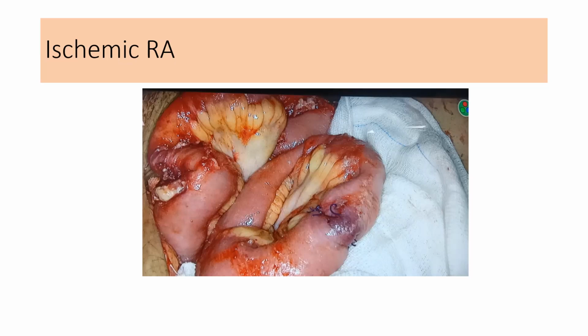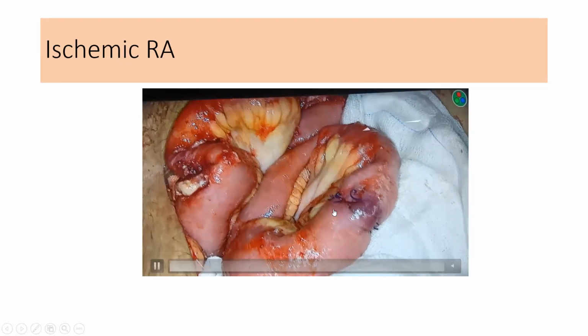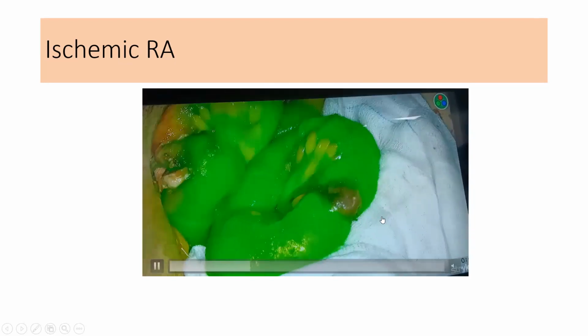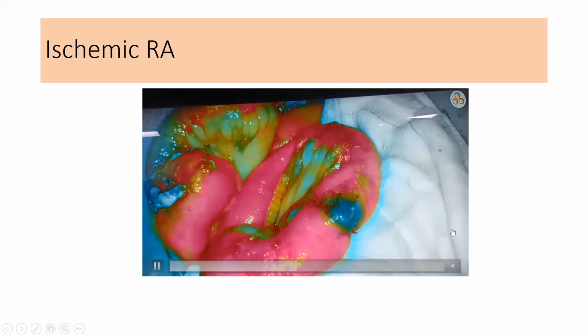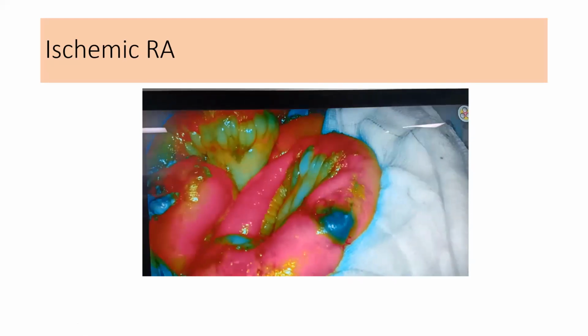This was a patient where the gynecologist inadvertently had gone through the mesenteric border of the intestine while putting his port in a previously operated case. There were adhesions, and he did suturing, beautiful suturing. So we did an ICG study there, and it detected that that particular mesenteric border definitely had no vascularity. So we proved that because it is non-vascularized, we will have to do a resection anastomosis, not just suturing. That is how it will prevent a catastrophe. The fecal fistula and fecal peritonitis will be prevented.